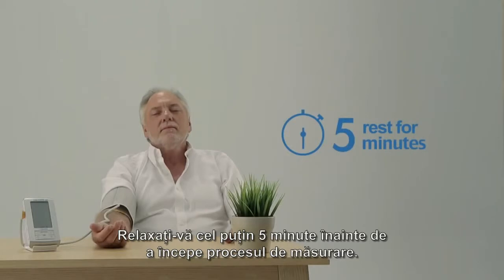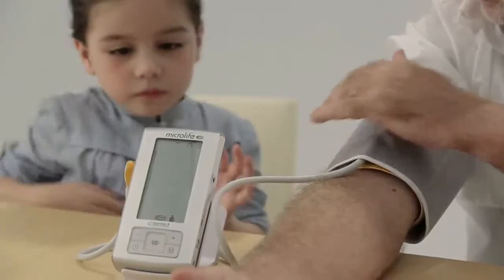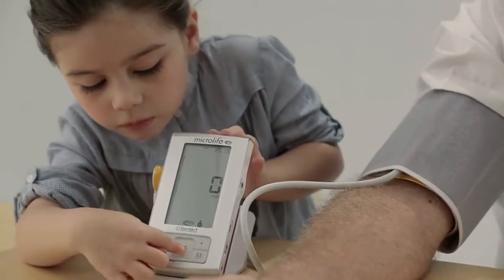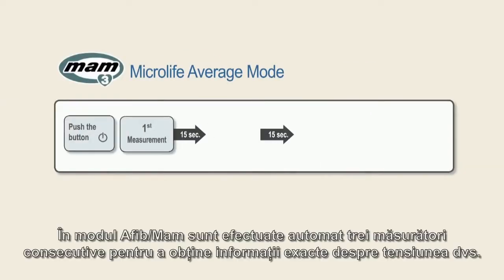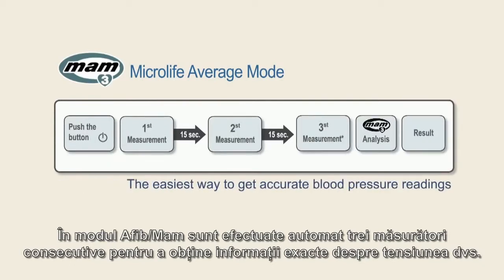Relax for at least 5 minutes prior to the measurement. Press the start button. The device will initiate a 15 second countdown. In AFib mode, 3 consecutive measurements are automatically performed to get accurate blood pressure readings.